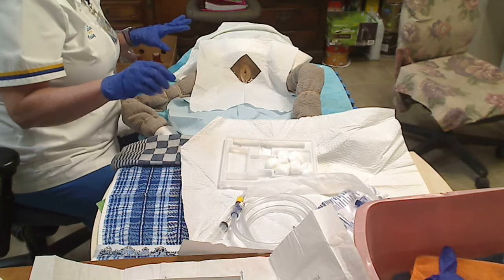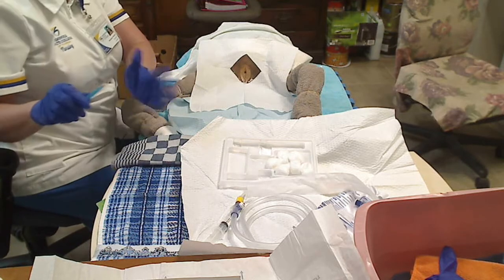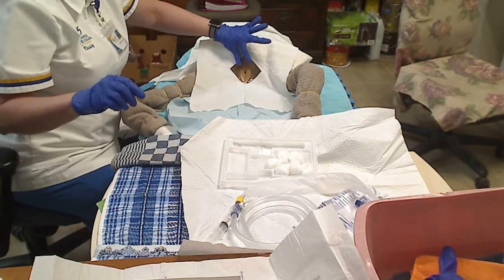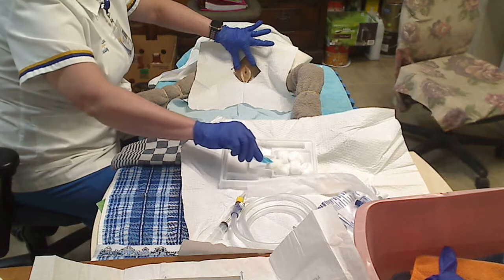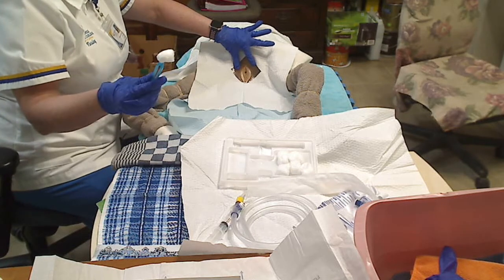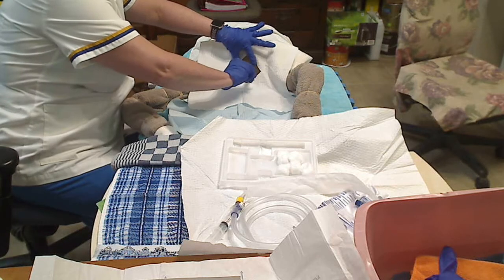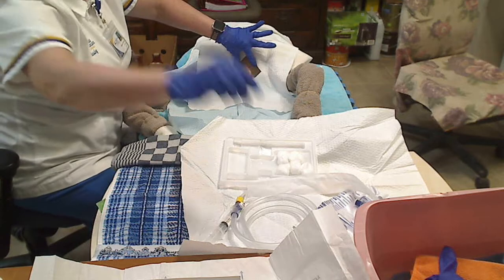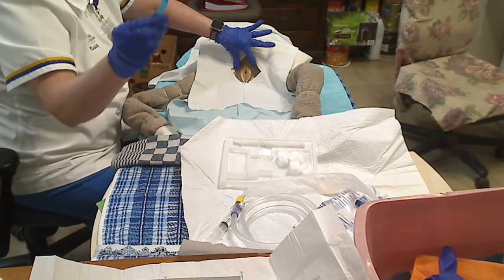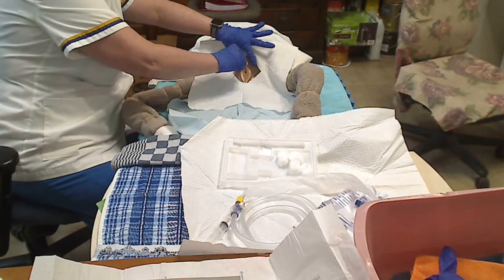The first thing you're going to do is you're going to feel something a little cool because I'm going to clean the area. Using my non-dominant hand, I'm going to go ahead and spread apart the labia. With my tongs, I will use one cotton ball, go to the distal side, start from top to bottom. I will clean down. I will take it. I will drop it. I will grab one more. I will come to the proximal side, closest to me, top to bottom.